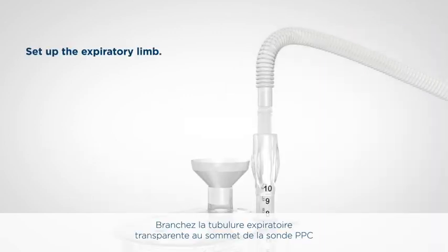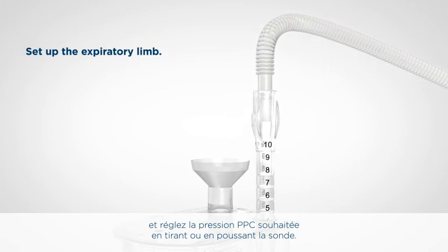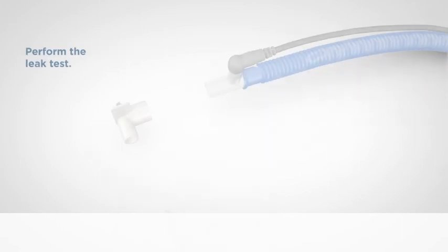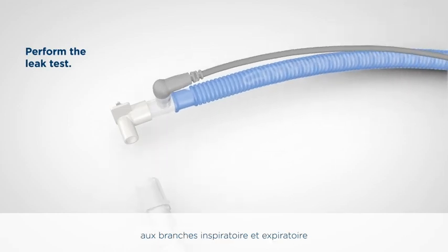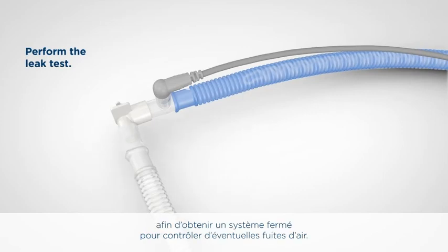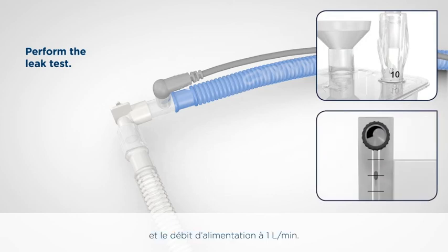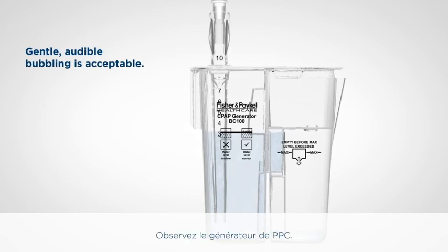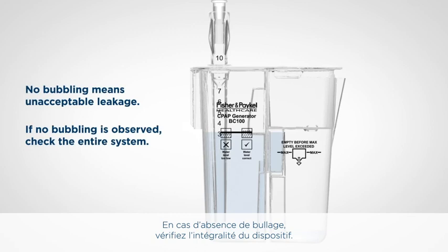Connect the clear expiratory tubing to the top of the CPAP probe and set the desired CPAP pressure by pulling out or pushing in the probe. Connect the test flow elbow white connector to the inspiratory and expiratory limbs to obtain a closed system for checking air leaks. Once the elbow is in place, set the CPAP probe to 10 centimetres of water and the input flow rate to 1 litre per minute. Observe the CPAP generator — gentle, audible bubbling is acceptable; no bubbling means unacceptable leakage. If no bubbling is observed, check the entire system. Remove the correct port cap from the pressure manifold before connecting any monitoring device.